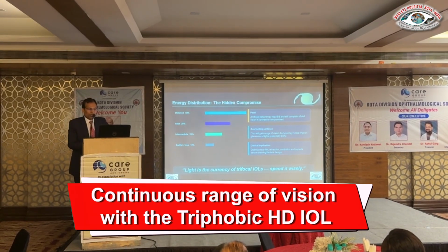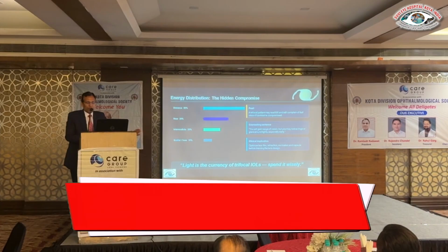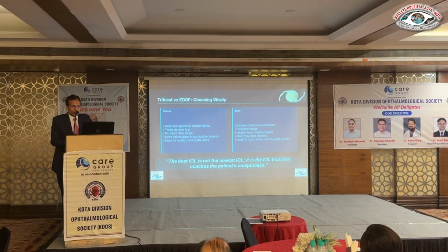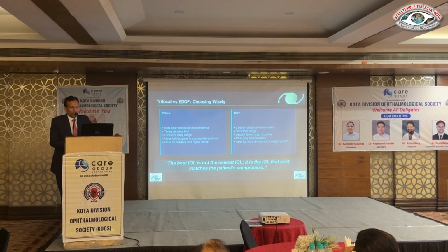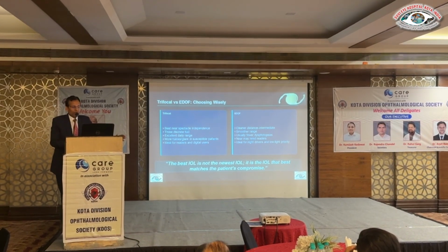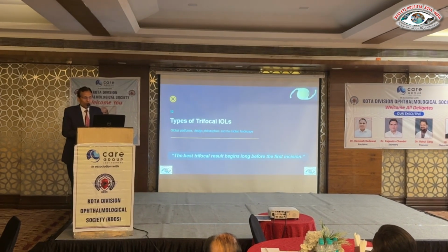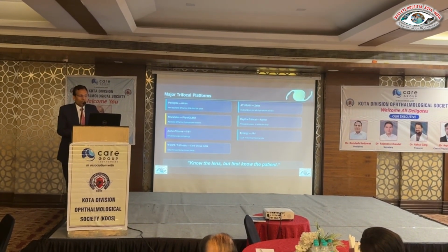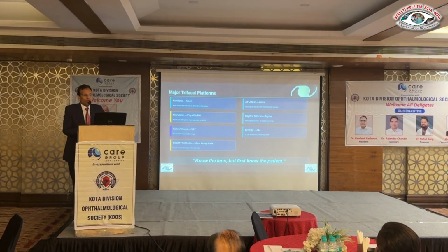And there is energy distribution. For a trifocal lens, light is the currency, so spend it wisely. This is the common saying for trifocal lenses. Once we compare trifocal versus EDOF lenses, the best IOL is not the newest IOL. It is the IOL that best matches the patient's compromise. So counseling and assessment of the patient's personality are very important, and we should always assess the personality and the needs of the patient, then select the trifocal lens.